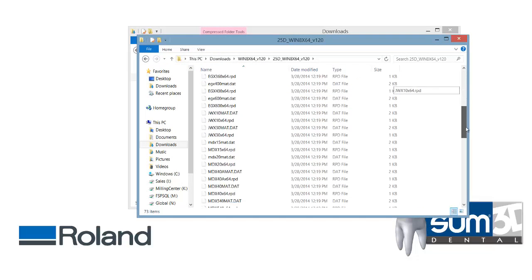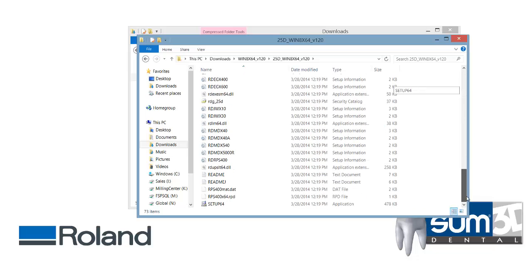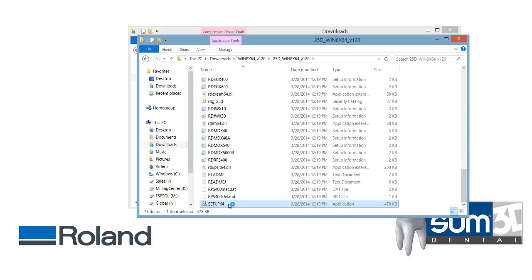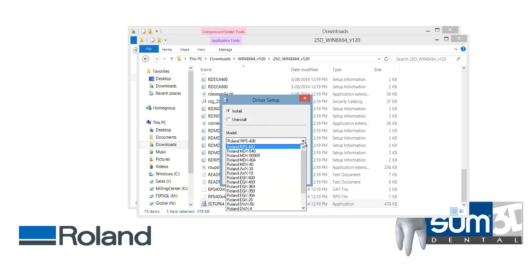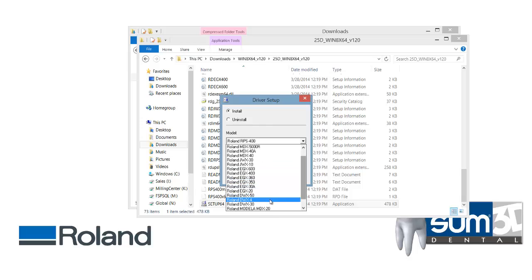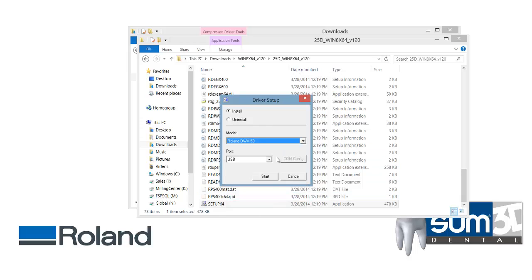Double click the folder and then run the setup. From here click install. In the model dropdown browse to DWX50, or DWX4 if you're updating a DWX4 system. Leave the port as USB. Click start.